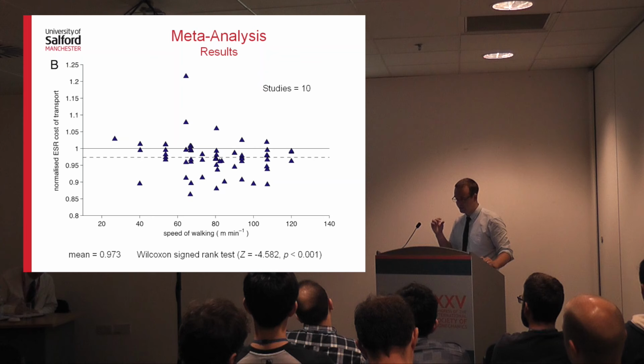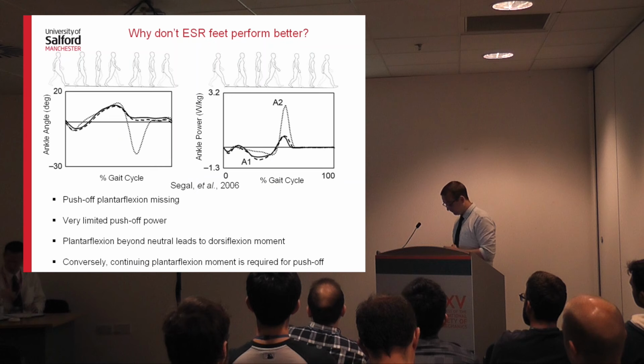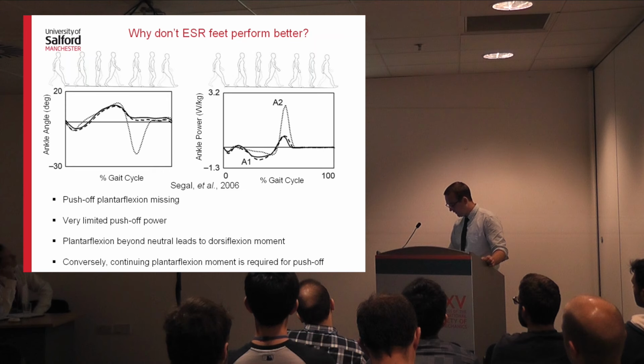Okay, so that leads us on to the obvious question, especially since manufacturers claim that these energy saving and return feet are more efficient for amputees to walk with. Why don't they perform better? What is it about ESR feet that isn't working?